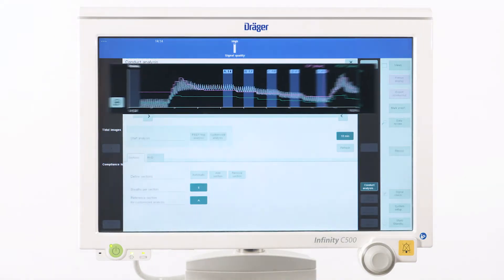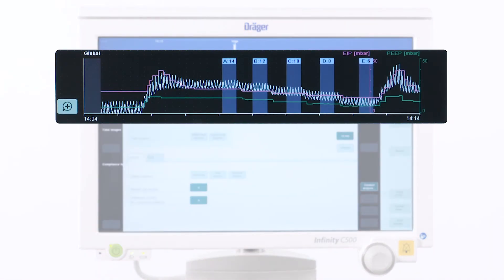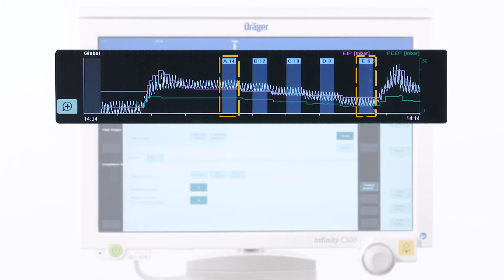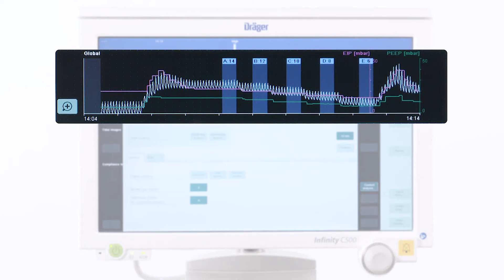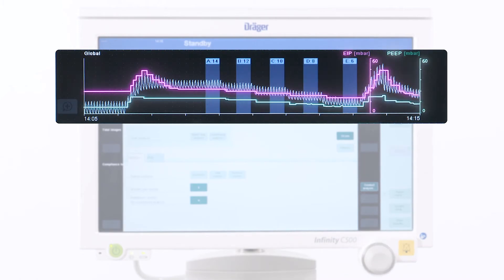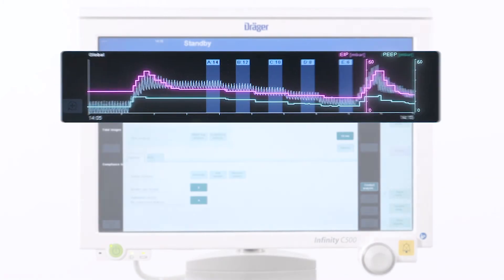In this example we will analyze a PEEP trial where the highest PEEP of 14 was stepwise decreased down to 6. If data from a connected ventilator, for example the VITA V500, is available, the PEEP and the end-inspiratory pressure will also be displayed in the waveform field.